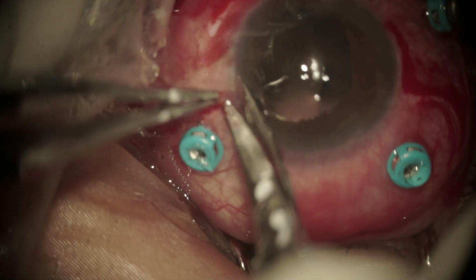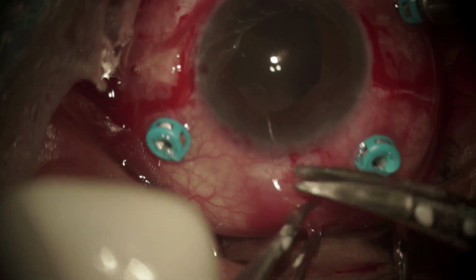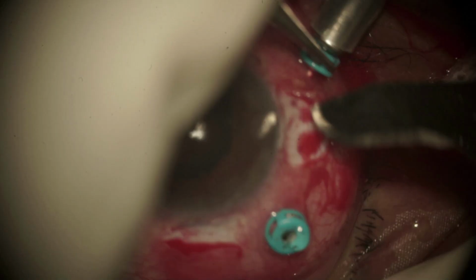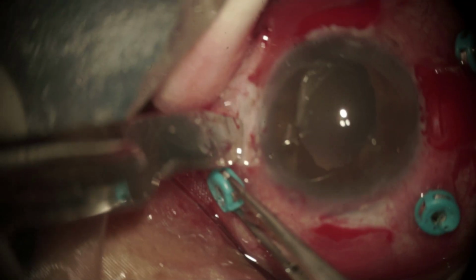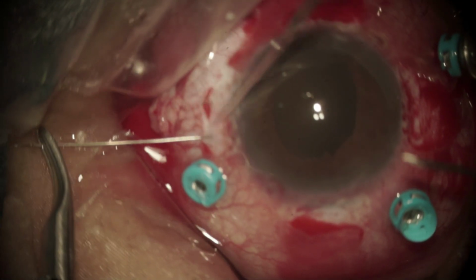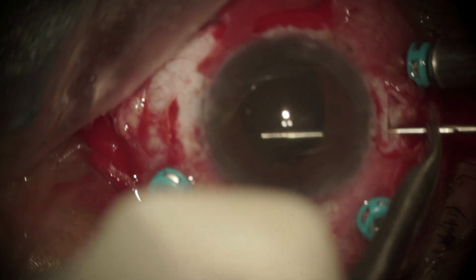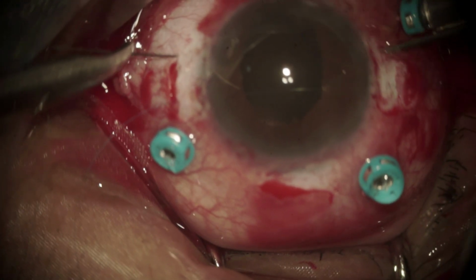Limited conjunctival peritomy is done at 3 o'clock, 9 o'clock, 12 o'clock and 6 o'clock. Four partial thickness scleral incisions are made tangentially at 3 o'clock, 9 o'clock, 6 and 12 o'clock, 1 mm posterior to the limbus. 9-0 polypropylene straight end suture is passed through the scleral grooves from 3:30 to 8:30 and brought out on the opposite side with the help of a 26-gauge bent needle.